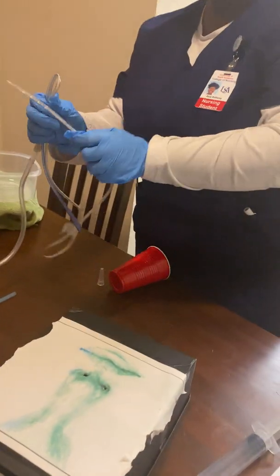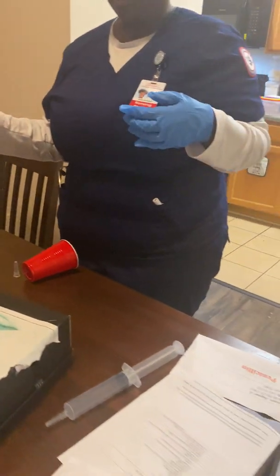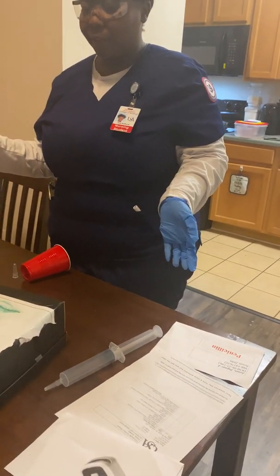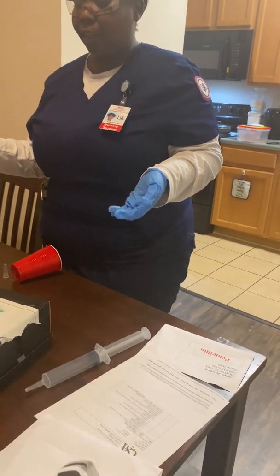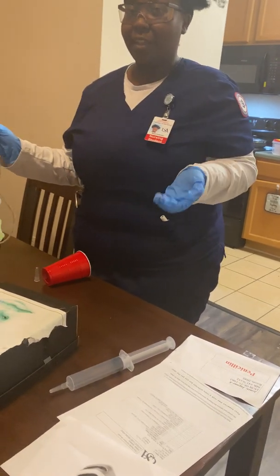And then at the end, I would get ready to document the amount of secretions that came out, and then I would get ready to perform oral care and go document, and that is the end of my procedure.